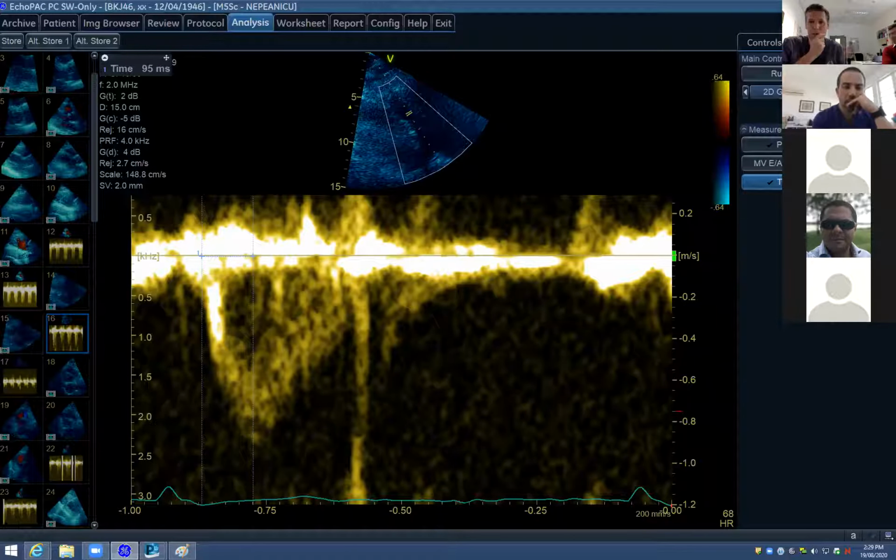You can also use formulas to estimate the mean pulmonary artery pressure from the pulmonary valve acceleration time, but I have to admit I have not committed them to memory. Yeah, and there's a reason for that: they're rubbish. It's an enormously complex equation that doesn't work very well when you've got tachycardia, or certainly hasn't been validated in the critically ill, and I'm pretty sure it's been validated on about 20 patients in the non-critically ill. So no, I don't use them. I don't mean to bag out the people who did that great research, but I agree, I don't use it a lot.